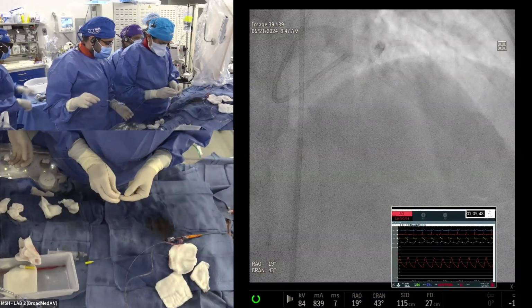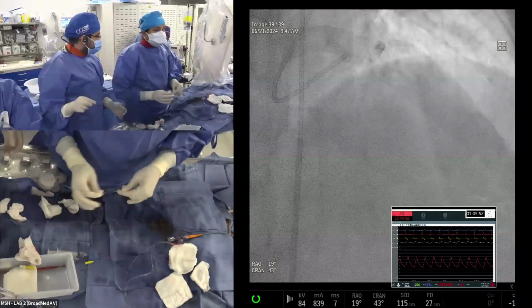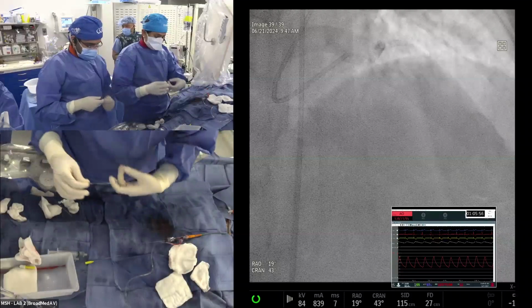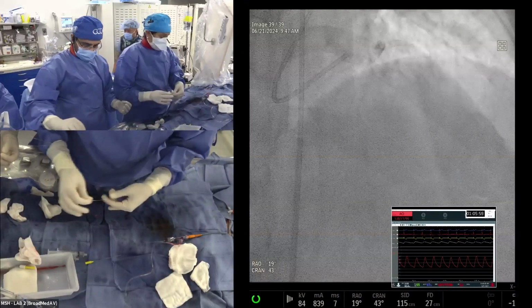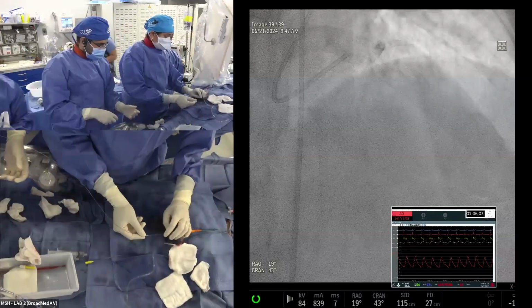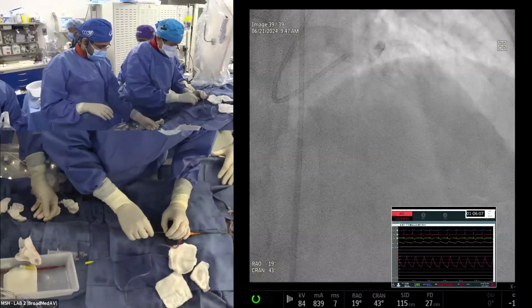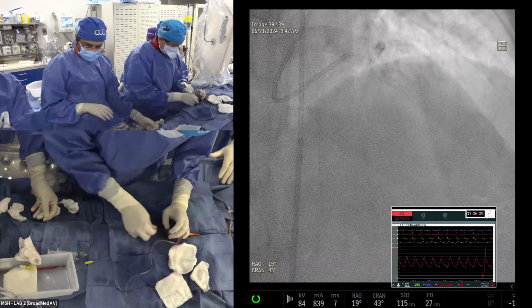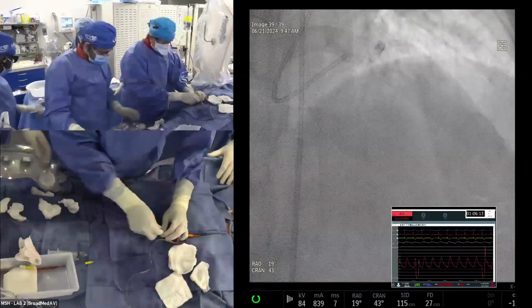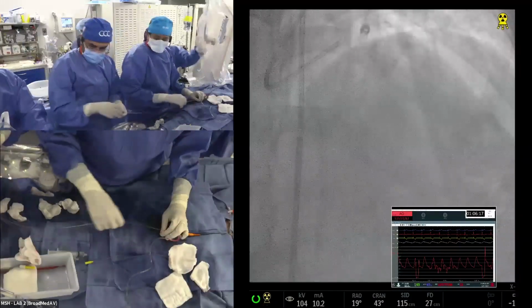And tell us the burr is done, now you are putting a wire? I'm going on the rota wire. Okay. So we have a 3.5 cutting balloon for the LAD, and I would do the rota. If you want to do the rota of the diagonal now before you cut. No, the cut is okay. Dissect? No, it will not dissect. We saw that when the rota cut, with a 3.25 by 6 millimeter Wolverine, we did not find any more dissections compared to high pressure.